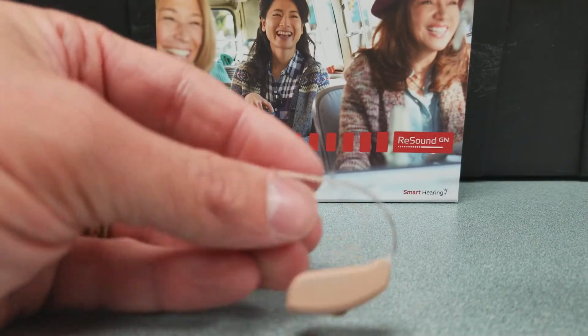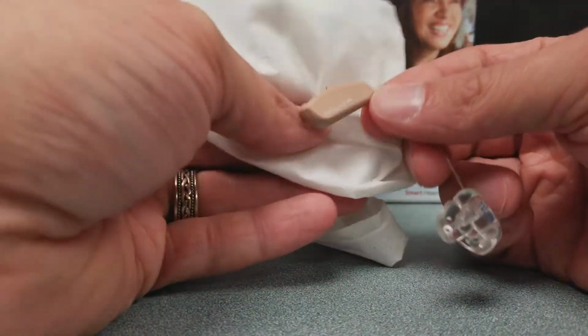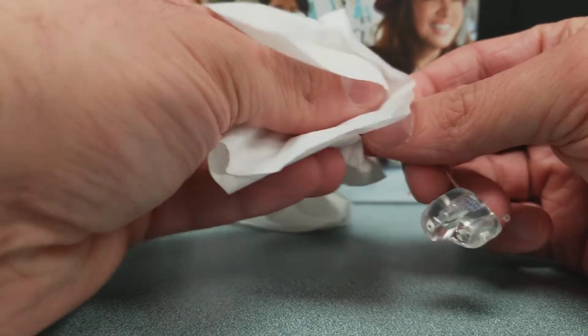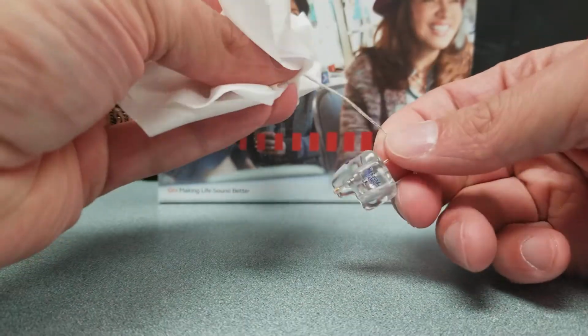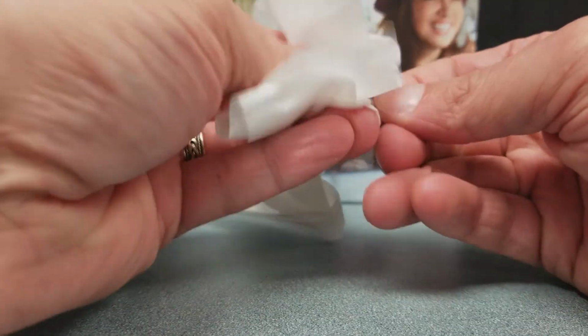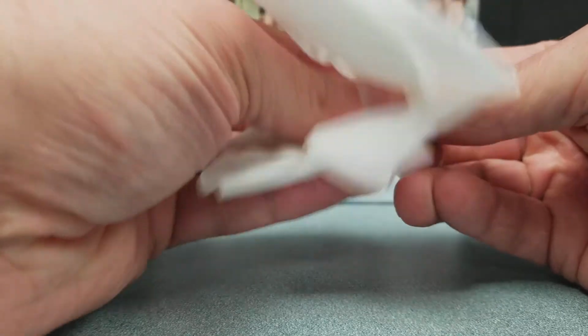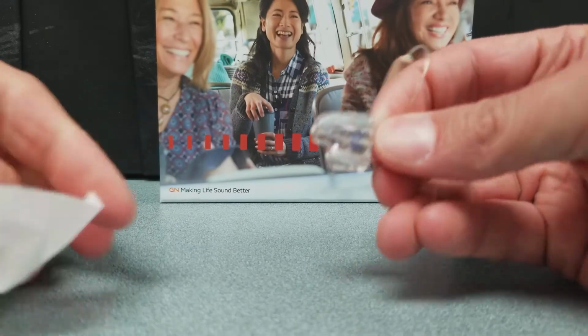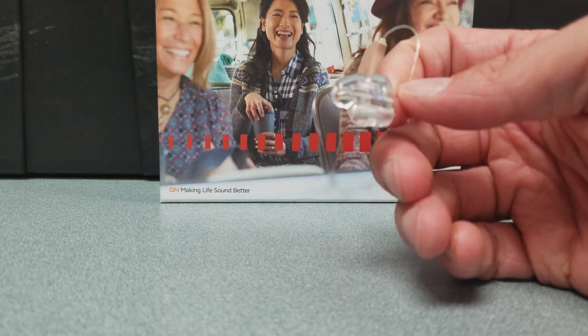Now, you want to clean your hearing aids every day. How we clean our hearing aids is you're going to take a dry tissue, start with rubbing down the hearing aid portion in the morning time, and then once you do that, you're going to then wipe down that custom ear mold. You want to really rub it down well, because if you don't get all the wax off, it's going to start to develop rings like a tree, and it's going to keep growing and growing and growing until it doesn't fit in your ear properly, and then it's not going to work like it should.